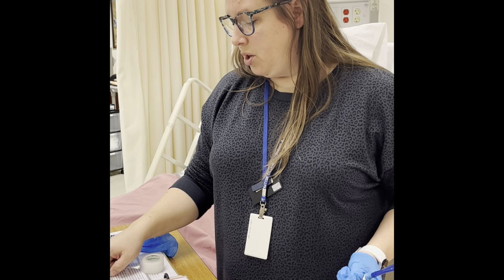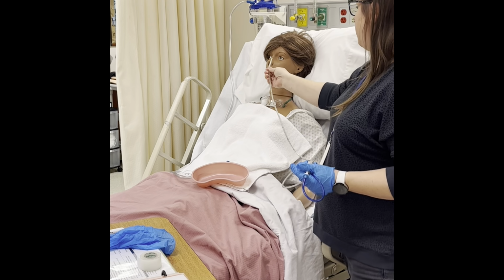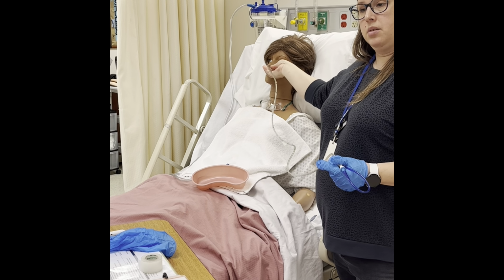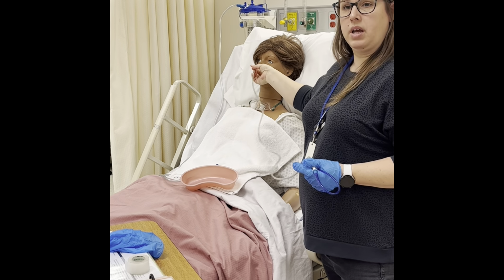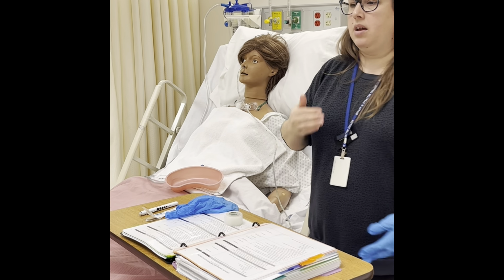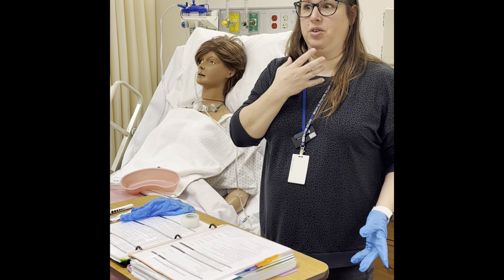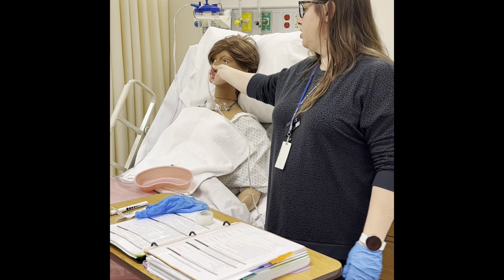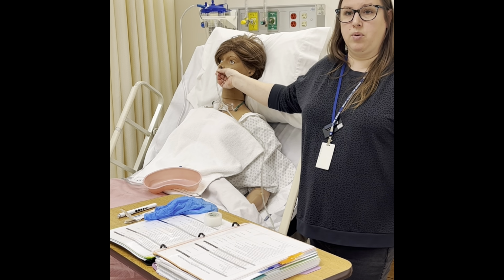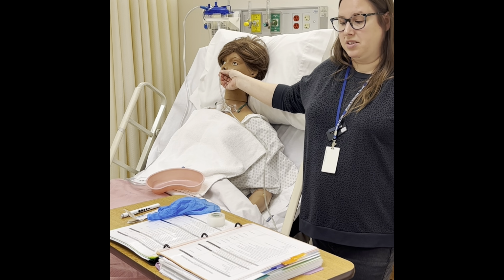And then it tells you to continue to pass the tube if there's no resistance. If resistance is met, we could rotate. What that means is when we stick this in, if we feel that there's resistance right here, we could twist it. Sometimes we need to twist as we're putting it in to help. And then we're gonna go till we get to the back of the nasopharynx, meaning the back of the gag reflex. You'll know. Your patient's eyes will get big. They'll probably start to water. You'll hear them gagging. Just pull it. It says withdraw a little, meaning just a tiny bit, and just wait. In real life, we wanna wait. I wanna give them a breather, collect their thoughts of what just happened, because it could be traumatic to get that in.